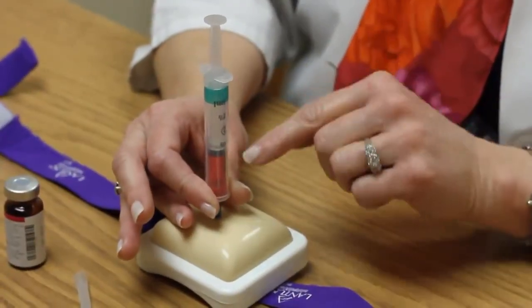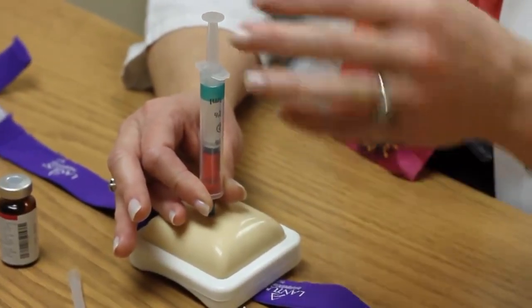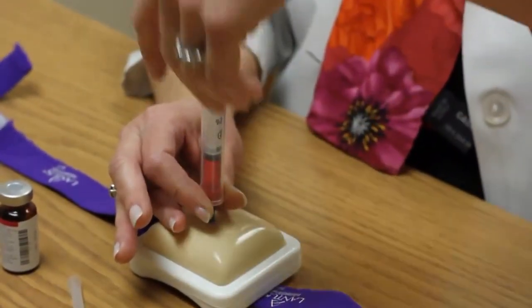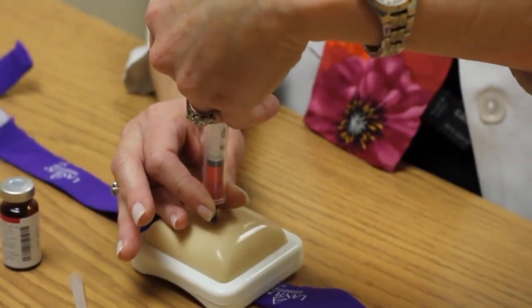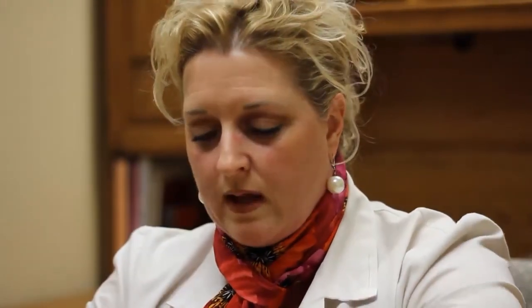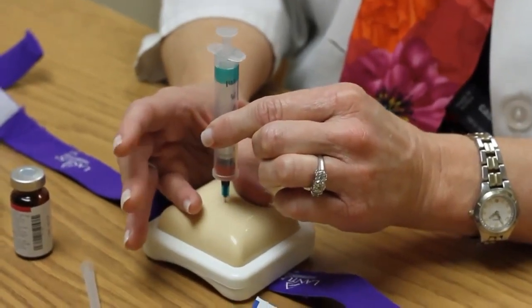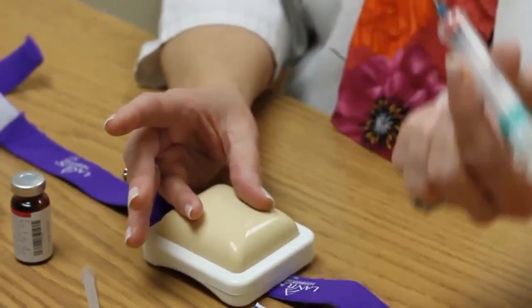I've got it stable so I'm not going to move the syringe while pushing the medicine in. I take my free hand, grab the plunger, and push the medicine into the skin. You don't have to go real slow and you don't have to go real fast — just go at a gentle pace. Then let go at the surface of the skin and pull straight back out. You're done.